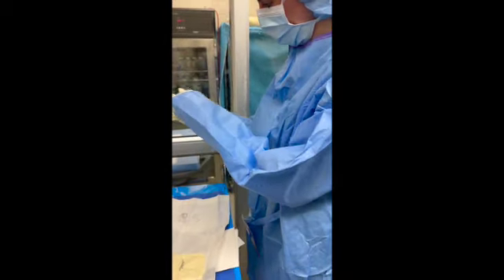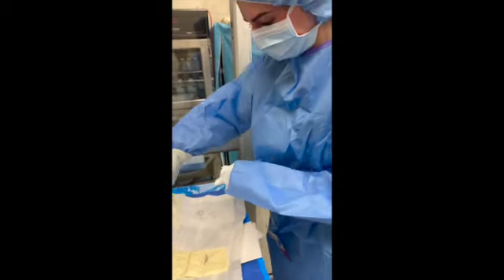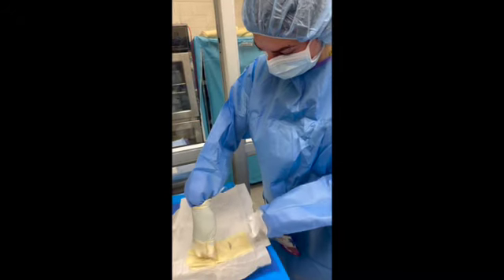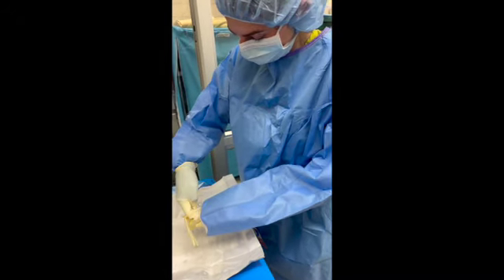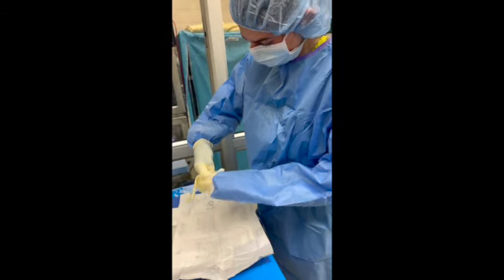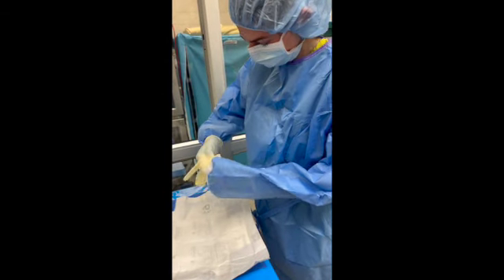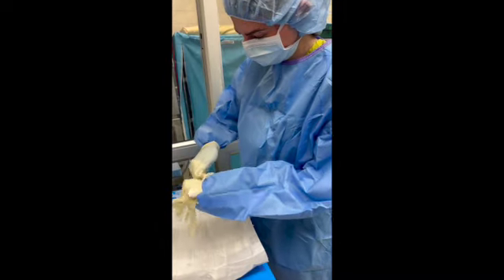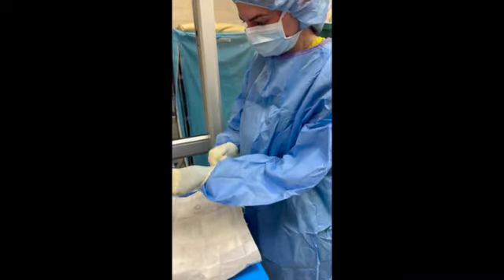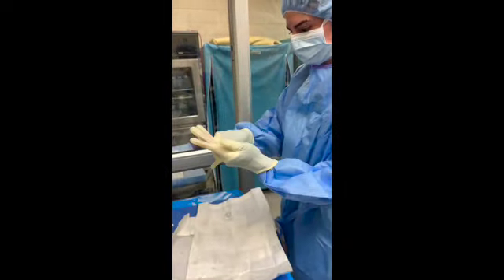Once you get the other one on, you can do your adjustment. Normally what I do for my other one is I will just take a needle and put it around here. You know, this is the connector. Can I check this one? Yes. And your last name.